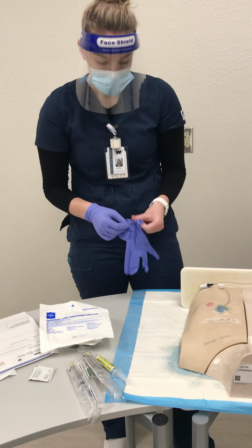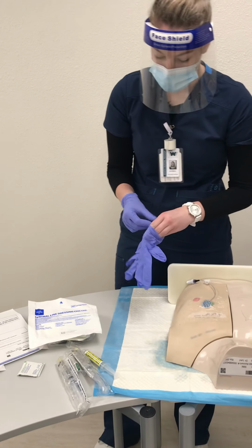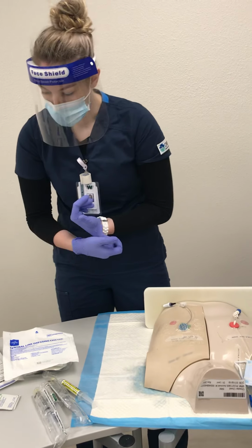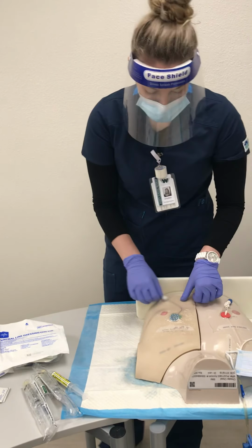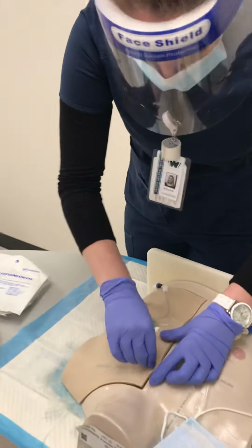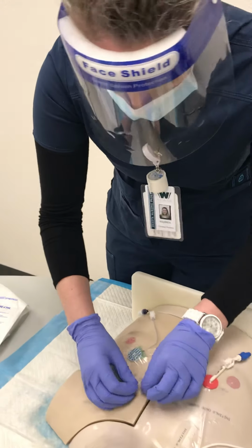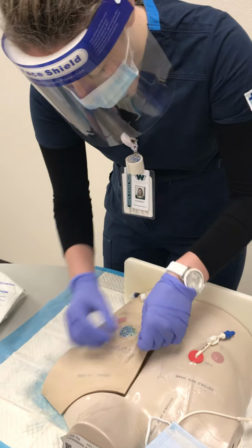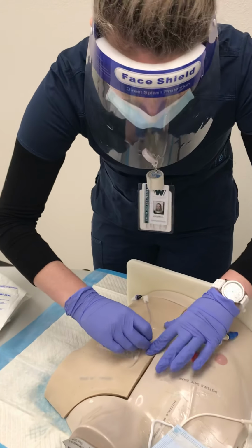So while I'm doing this, I want to assess the port site and make sure that it's within normal limits, that there's no signs of infection and all that. So first we're going to take off this dressing. So we're going to peel up all the corners. We want to peel up all the corners and then pull it inwards.